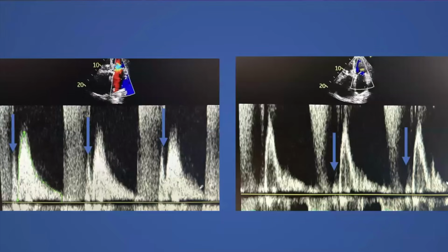This is the last case. And this case, me and the fellows talked about it in a very long discussion. I came in on the weekend to search and spent 1 hour searching for this case. Why this wave, seeing the echo? So with this patient, when you do the pulse wave, you have your nice E. But when you do the CW, you have this flow. So it's coming from somewhere.